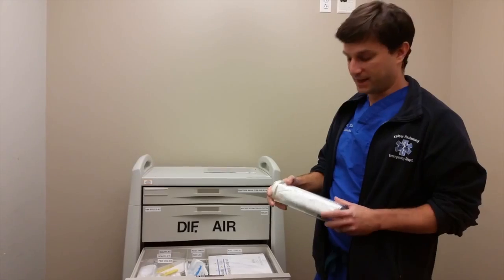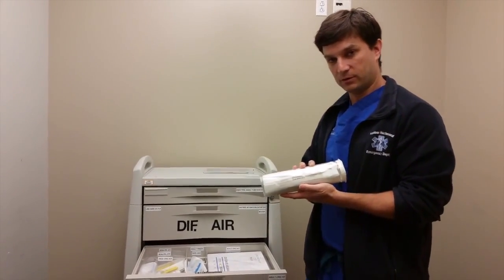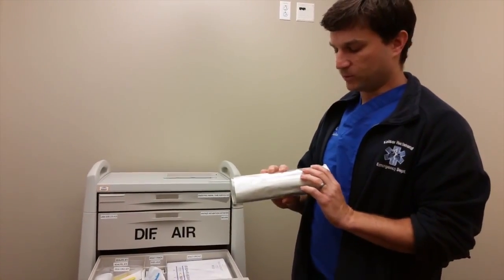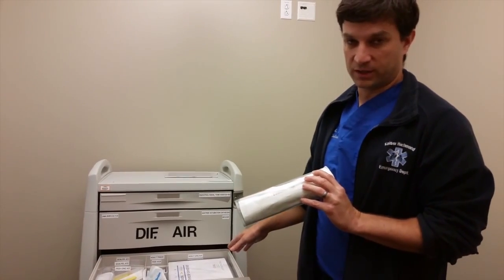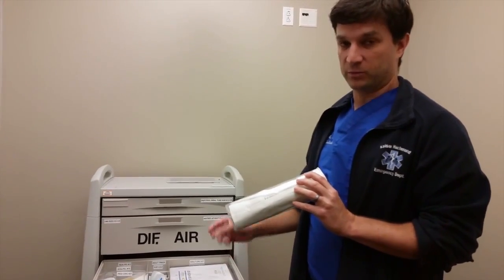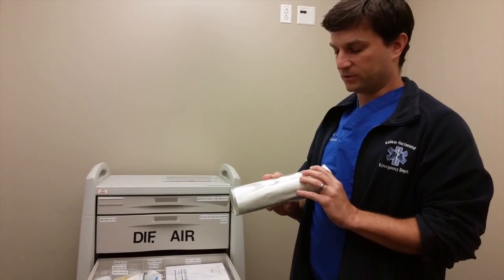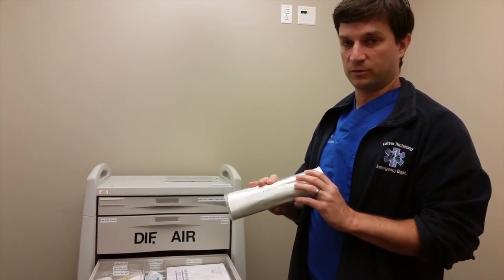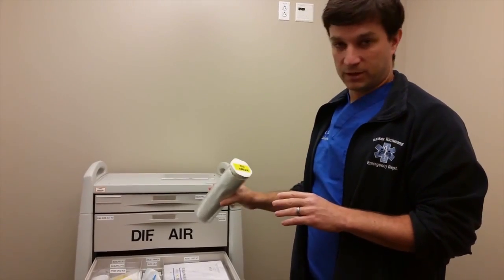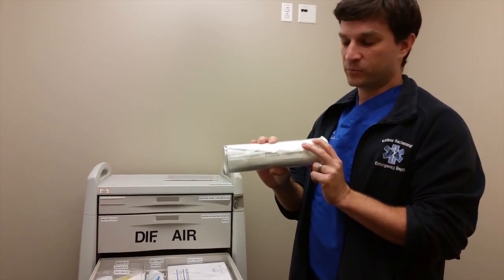As well as the universal cric kit in here, because this is meant to be a combined difficult airway cart for pediatrics and adults, there's a very much smaller kit called the PercTrach, and this is for the pediatrics population. The reason we kept this is because the universal kit has a 5 millimeter inner diameter cric tube. It's about 6 or 7 external diameter, but you can imagine that can be limiting in smaller children. So there's a size cutoff for cricothyrotomies in children in general, but there's definitely a child size that would be too small for the 5 millimeter kit. Would need something just a little bit smaller. So this has a 4 millimeter interior diameter kit.